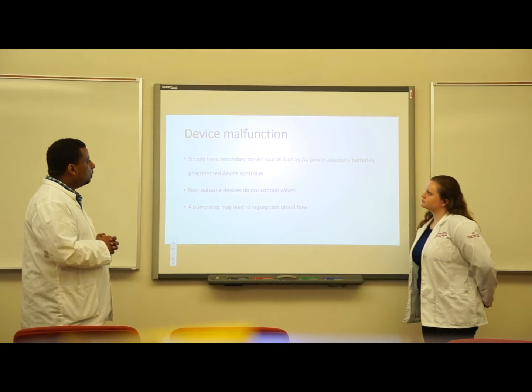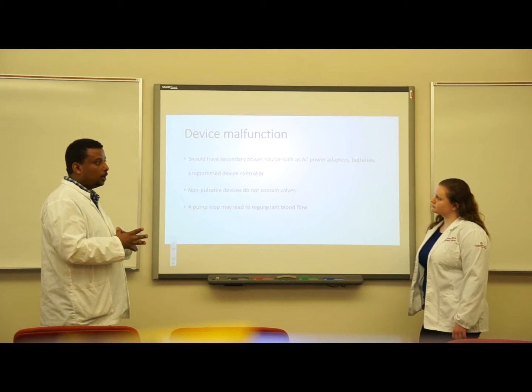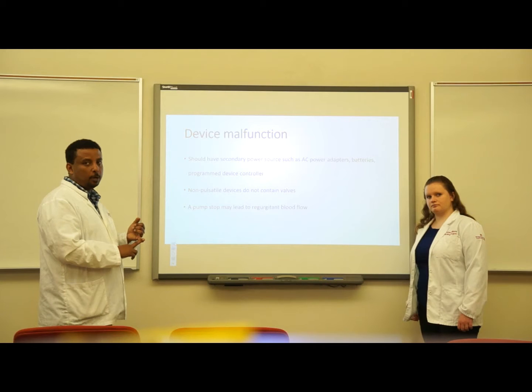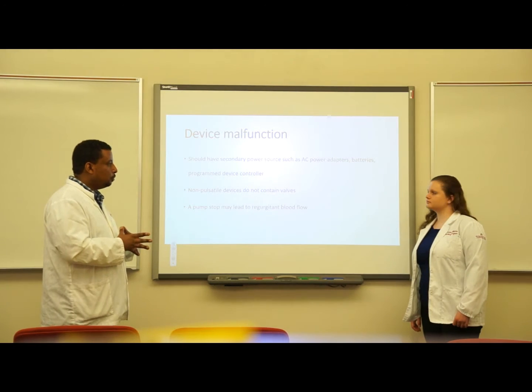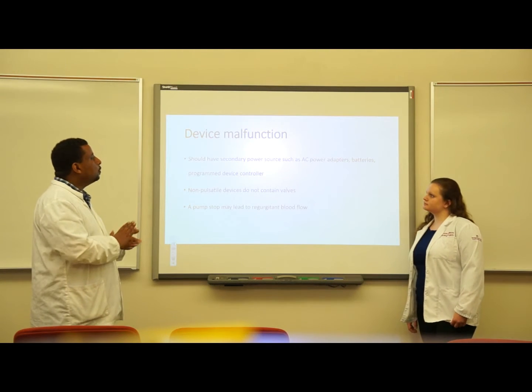The other problem we have is device malfunction. We are dealing with a mechanical system, so anything can happen. We may have power failure. The cord may be disconnected from the controller. So these things will have drastic consequences.